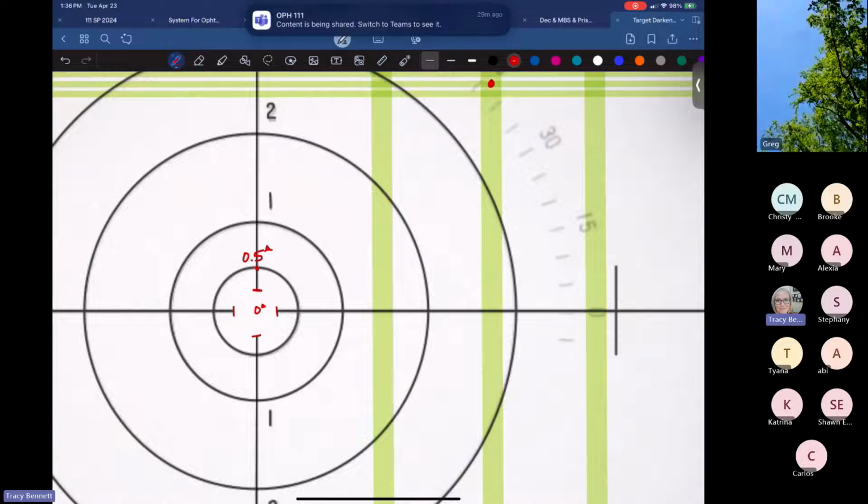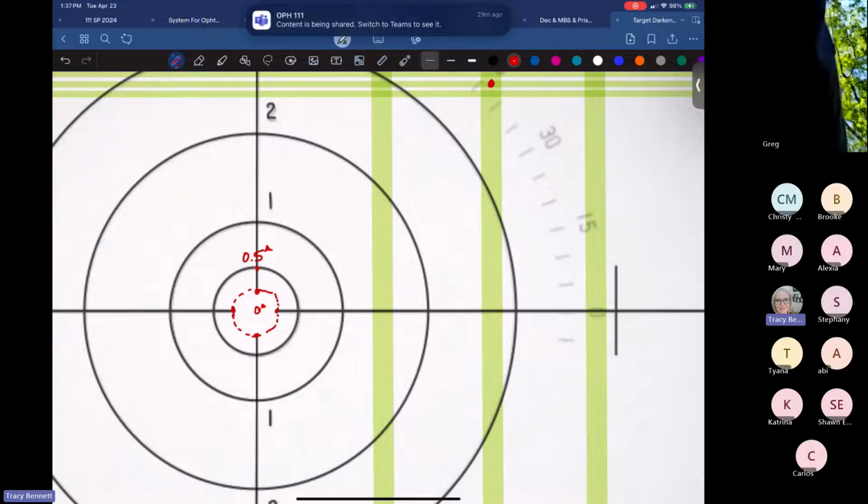And a quarter, and so that goes all the way around. These are like circles, okay? But they just don't, it would just get too cumbersome up in here to do that. But you need to still be able to imagine this. And this is an ABO thing as well, but mainly it is in my class. And this is how you use the lensometer. So they don't mark it, but this first point here is a half of a diopter. So, and just think about it. We're halfway between 0 and a half. So, I'm sorry, I didn't mean a half, the quarter. So this one's at a quarter.